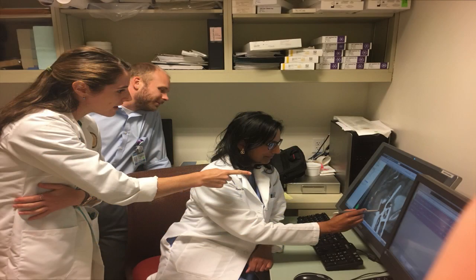After the successful delivery of your radiation treatment, your applicators will be removed. If your treatment plan involves an overnight stay in the hospital, you will be safely transported back to the hospital with the applicators to stay in place for subsequent treatment the next day. However, usually the applicator will be removed following the completion of treatment.